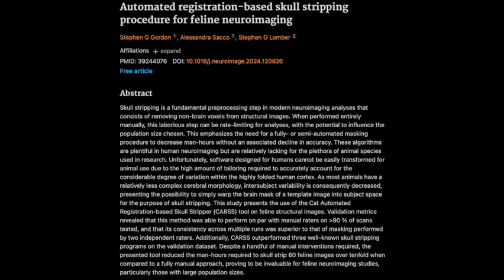And here's where it gets even more interesting. They ran CARS multiple times on the same images to see how consistent the results were. And get this. The Dice similarity coefficient score for those between-run comparisons was a near-perfect 0.998. That's remarkable. It means CARS was incredibly reliable, producing nearly identical results each time, like a well-oiled machine. Precisely. That level of consistency is crucial for researchers.